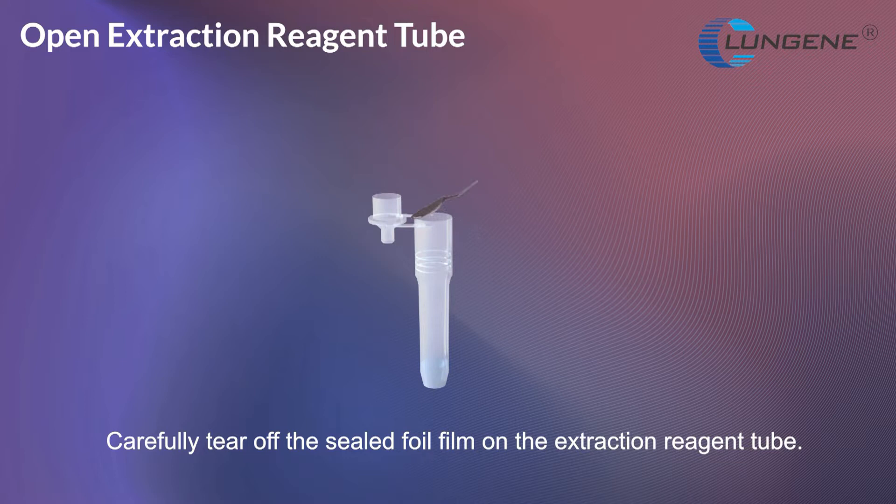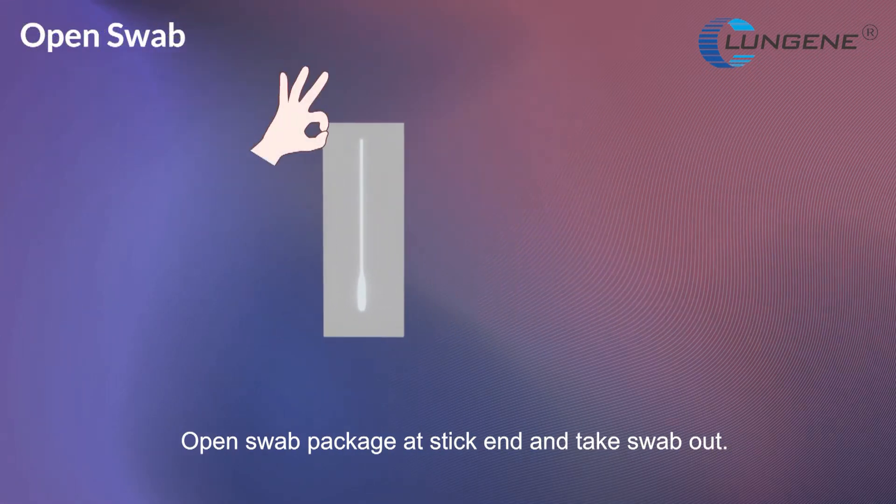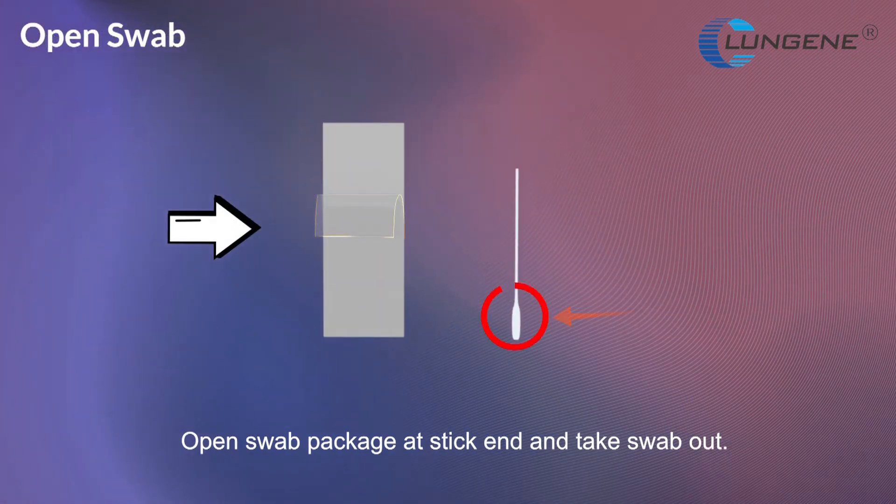Carefully tear off the sealed foil film on the extraction reagent tube. Press the hole on the box and insert the tube into the hole. Open the swab package at the stick end and take the swab out.